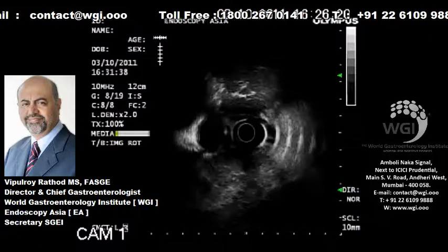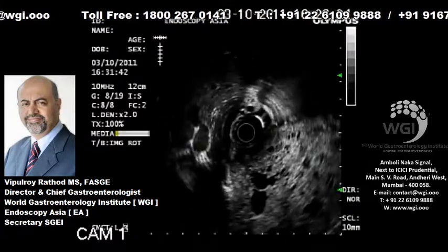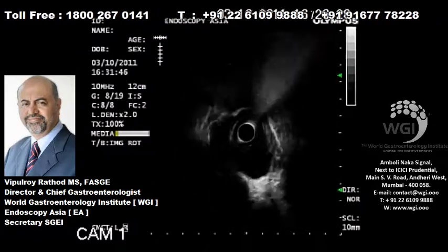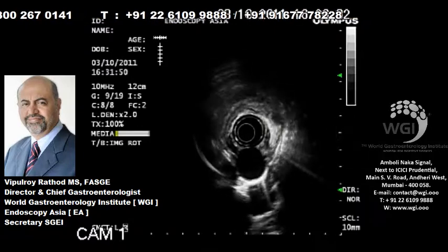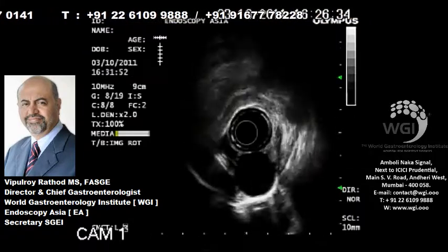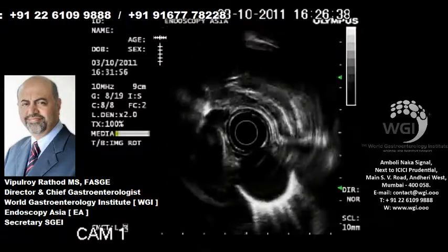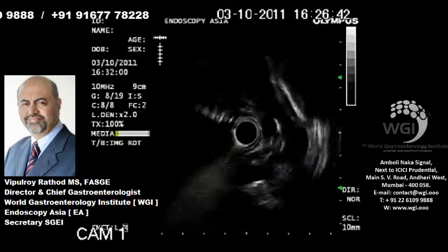We would like to go and take some tissue from the solid component of the lesion rather than going to the cystic spaces, because as we know, cystic neoplasms are more prone to infection. Studies have shown that. There are no lymph nodes which we have seen. We are going to see lymph nodes in the mediastinum. There are no nodes either. So now we'll proceed with the EUS-FNA.